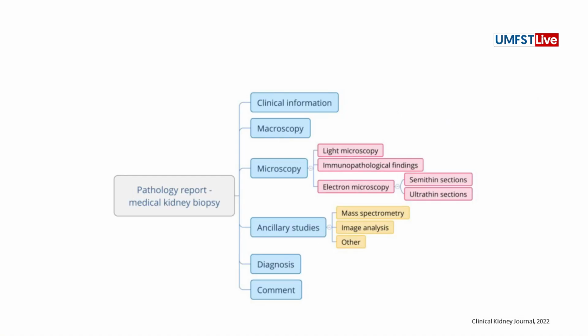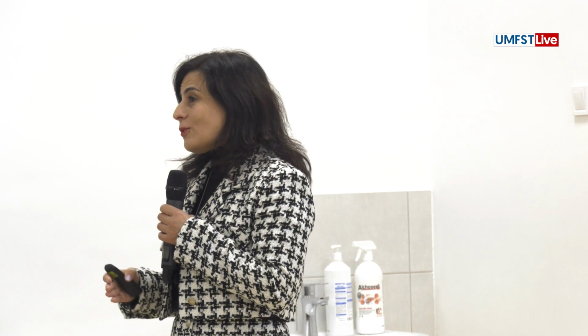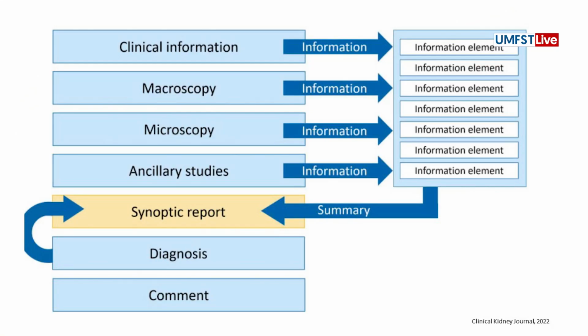We usually prefer, in kidney biopsies, whether transplant or medical, it doesn't matter, to have synoptic reporting. It's very important because we are giving some data for follow-up of the patients. That's why we need not only the diagnosis, we also need clinical correlation in comments. That's why it's not easy usually. We have long reports. That's what I want to point out: synoptic reporting. We usually have a checklist.